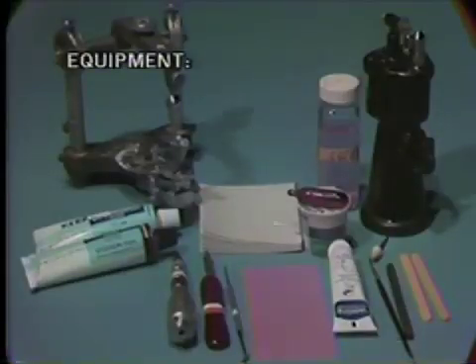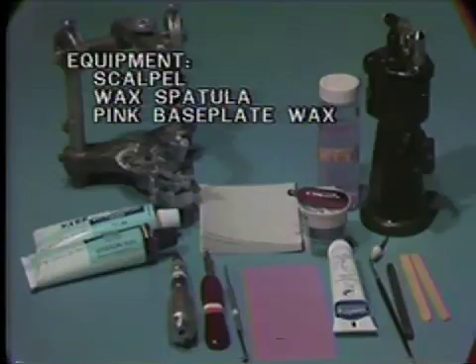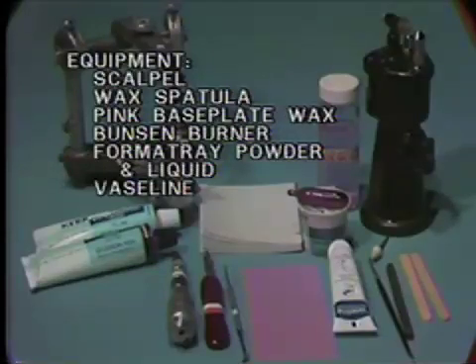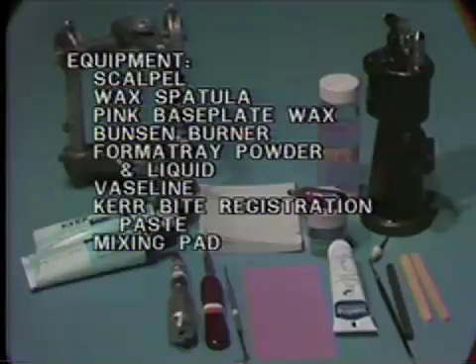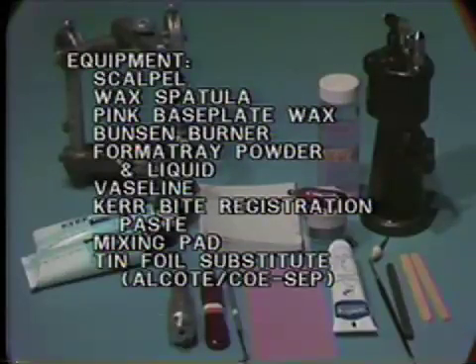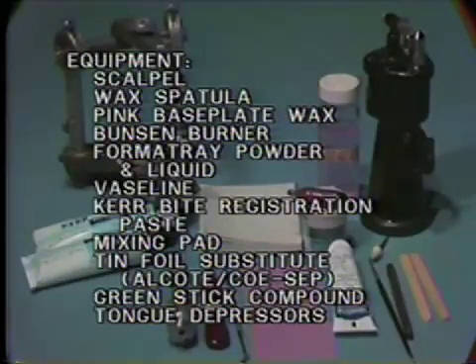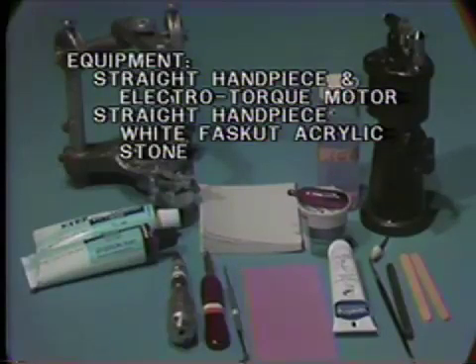The following supplies are needed: scalpel, wax spatula, pink base plate wax, Bunsen burner, Formatray powder and liquid, Vaseline, Kerr bite registration paste, mixing pad, tin foil substitute, green stick compound, tongue depressors, straight handpiece and motor, handpiece white Faskut stone, and an articulator.